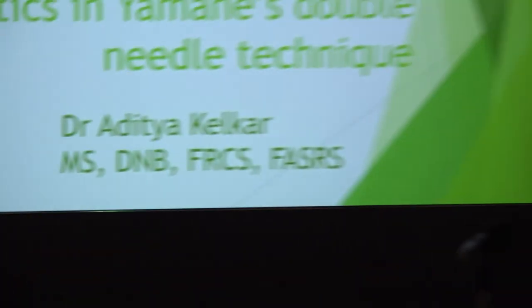We are going for our next speaker, Dr. Aditya Kelkar. Thank you, Dr. Boral. I'm going to present a short video on a slipped haptic while performing the MIOC 2022. That's the kind of situation I landed up with: a patient who was a high myope post RK, with a dislocated whole bag complex, and surgery was going smoothly. Vitrectomy was done, PFCL injected to protect the posterior pole, and the plan was to remove this bag complex out with forceps.